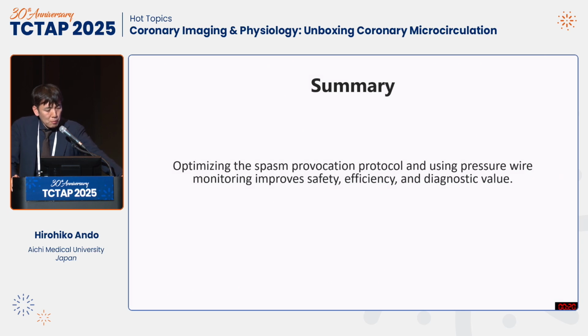In summary, optimizing the spasm provocation protocol and using pressure wire monitoring improves safety, efficiency, and diagnostic value. Thank you very much for your attention.